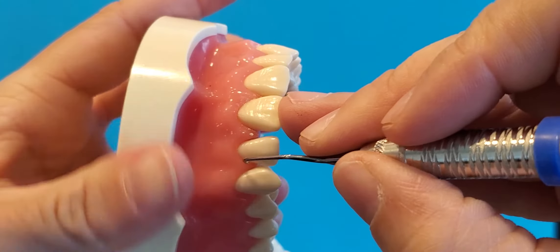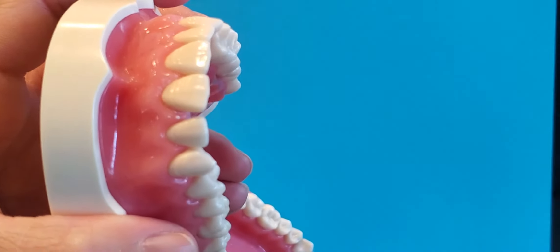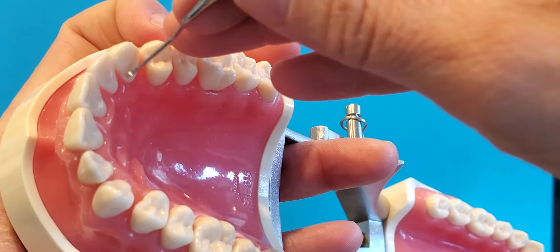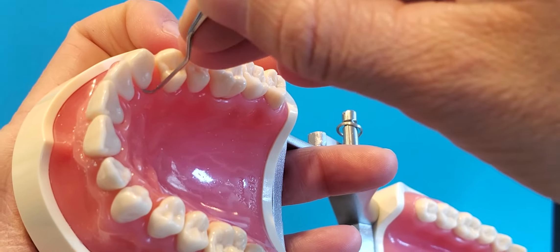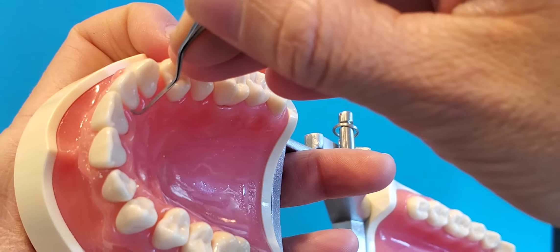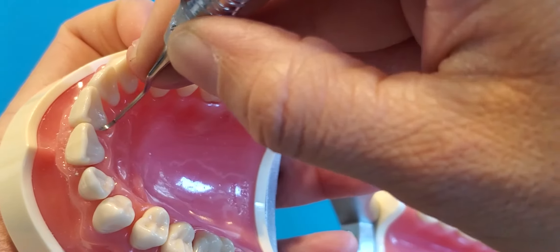And then I would suggest staying in that same clock position, flip ends, and now you're ready to do all of the surfaces toward on the lingual. Not showing correct stroke here, just the sequencing.